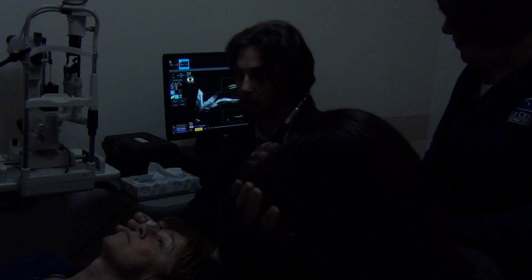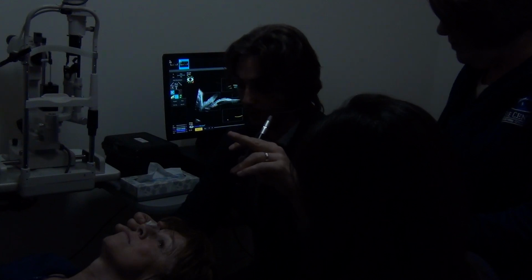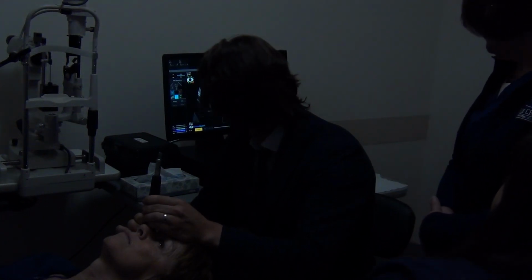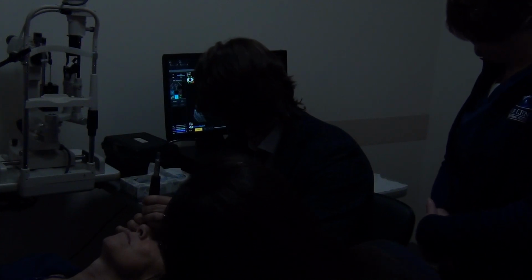Remember, it's recording the videos, so we can always play back. If we need to scan angles, look at my finger and just stare there. The marker is nasal at this point, and I'm scanning an angle. We don't need eye tracking software at this point. It's still there, but we can see the perfect image of an angle itself.